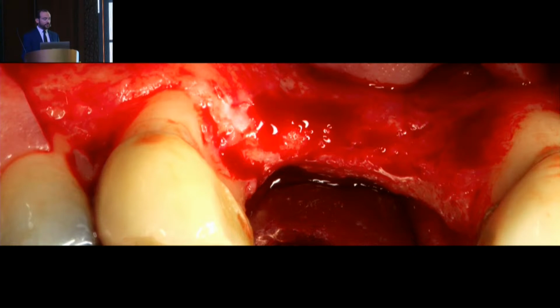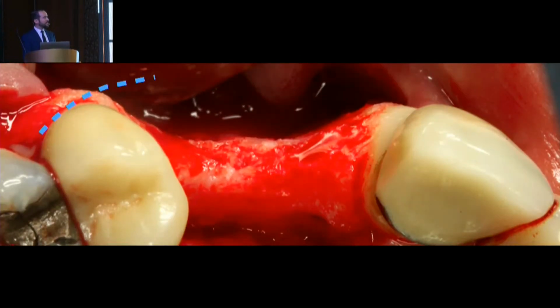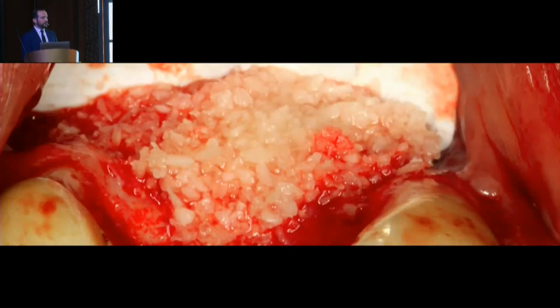We proceed with the surgical procedure. We do, of course, full thickness flap elevation. We want to expose the defect, and here we can see that little bit of the vertical component with the horizontal component also of the defect. Here we can see, on the day of the surgery, we can estimate more or less how much bone we are missing. What is more or less the structure that this patient had prior to losing those teeth. And this is more or less what we are aiming to reconstruct so we can place the implant once again in the ideal position. So we proceed. For this case, we stabilized a non-absorbable PTFE titanium-reinforced membrane on the buccal side.